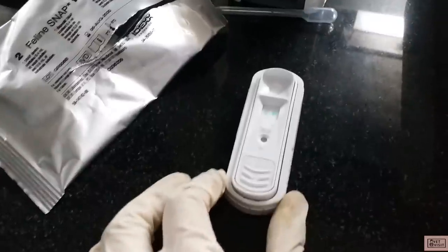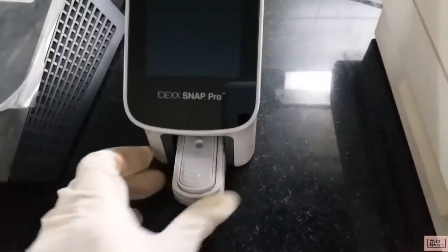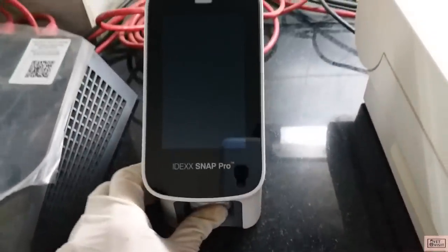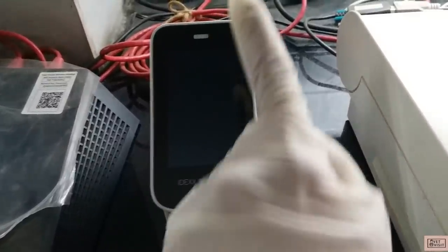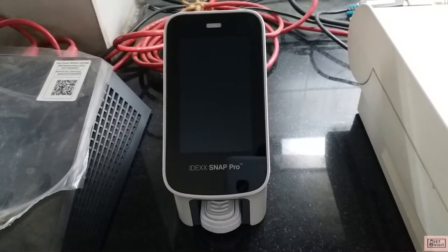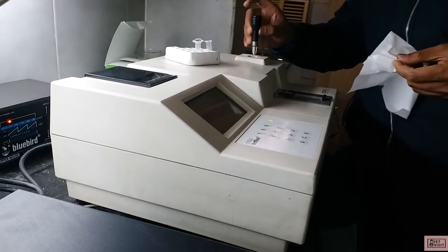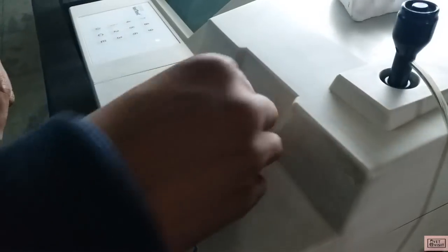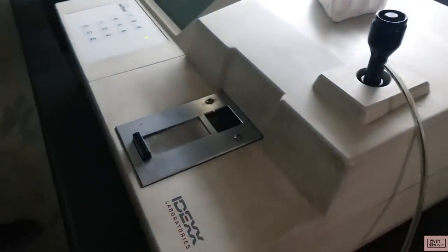Then we read the window for the colored spots and the results are interpreted accordingly. But if you are using a SNAP Pro analyzer, no need to snap it — just insert this into the analyzer and it will automatically activate the snap test and interpret the result. The next test was done using serum for canine LDH and GGT. These are the specific barcodes for it that go inside the device and the results are interpreted.